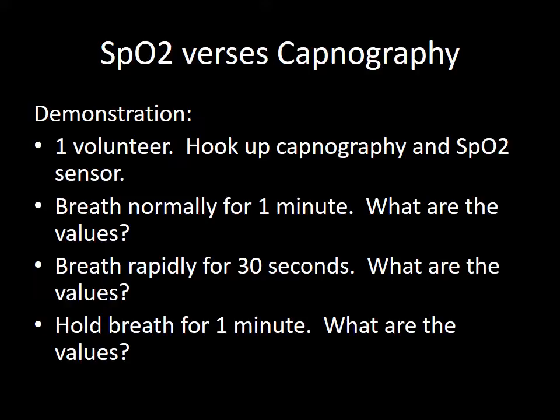But let's say then, to do this experiment, breathe rapidly for 30 seconds. What do you think happens to the capnography? It actually decreases, and the SpO2 may increase a little bit or may stay the same. But try to hold your breath for 1 minute and then breathe. Your next breath, right after you held your breath for a minute, or really as long as you can if you can't go a whole minute, the next value for your capnography, remember, you've held on to all that carbon dioxide for a while.